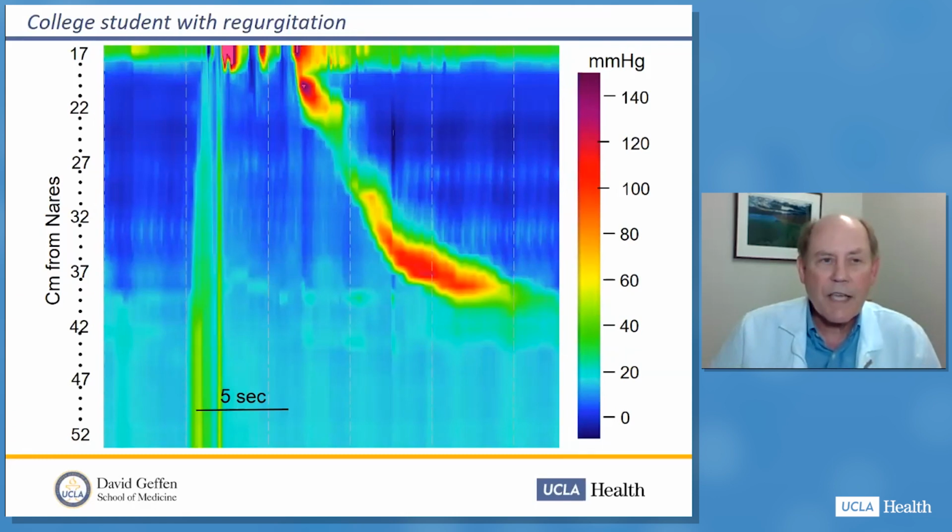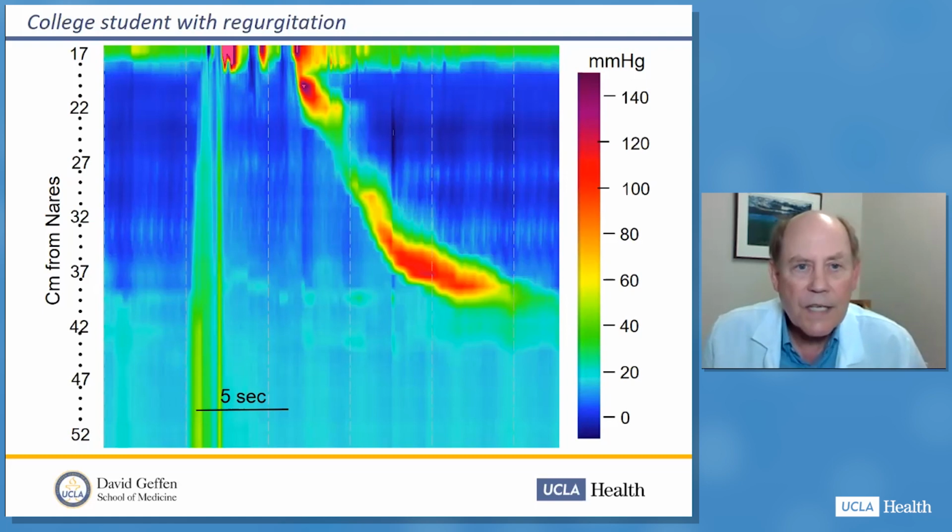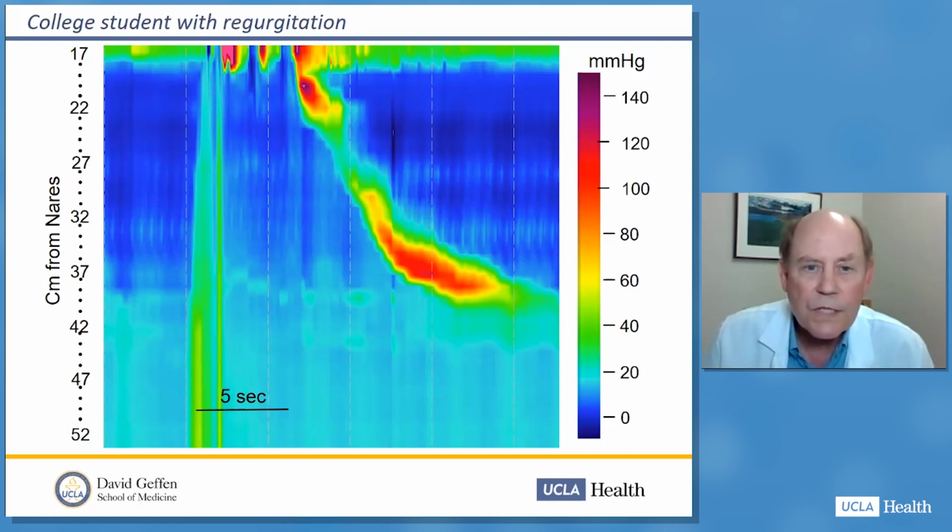So this is a quick case to show you how this technology might be used, the impedance might be used to help make a diagnosis. This patient was a college student with regurgitation. If you look carefully here, you'll see that right here is the esophagogastric junction. This is a Valsalva. So this is the pressure in the stomach.